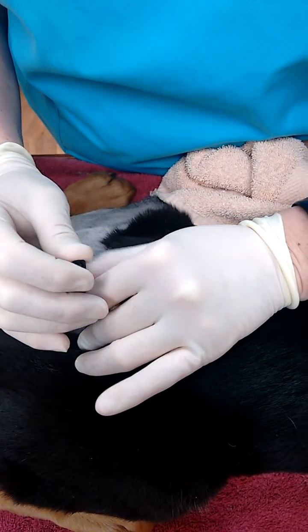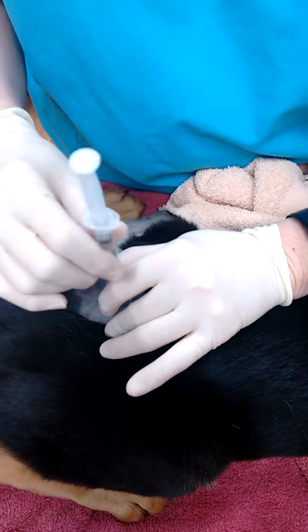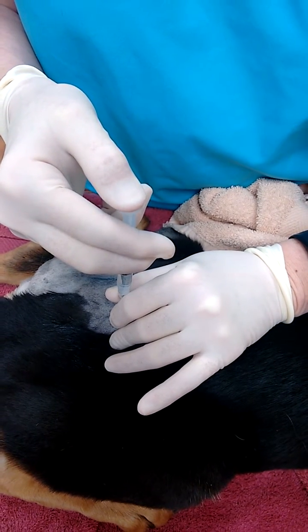And then you pull this out. And then I have my syringe. And then you're putting this in.